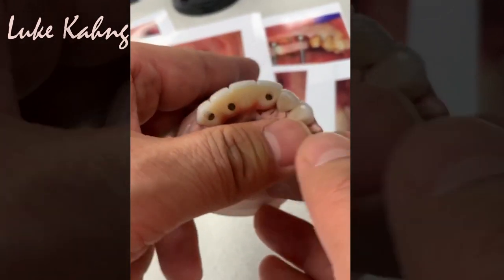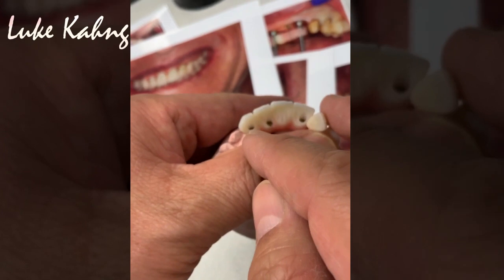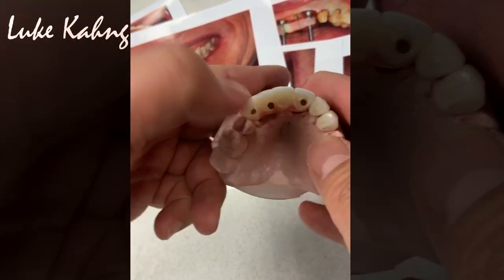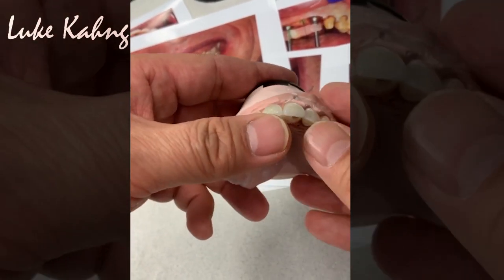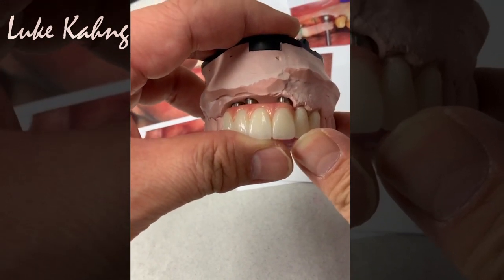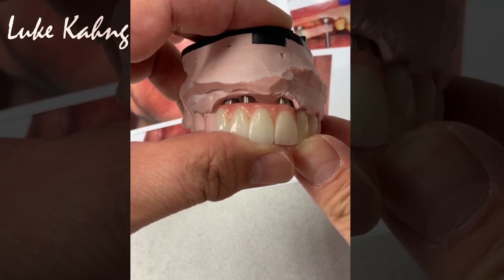Canine. So here's a little bit slightly out because of the screw access hole. It wasn't really out. So I'm trying to bring it in, but I just make it a little more deeper. There we go. We don't get the break. All right. Now we can update it after we cemented this final case.